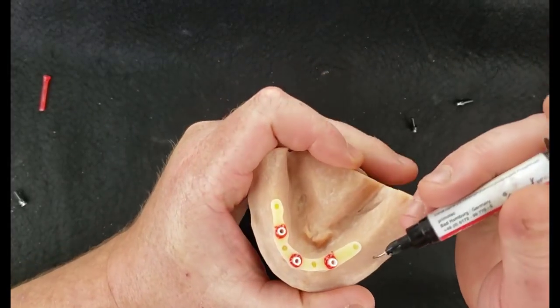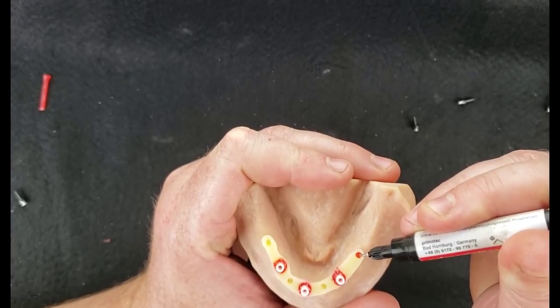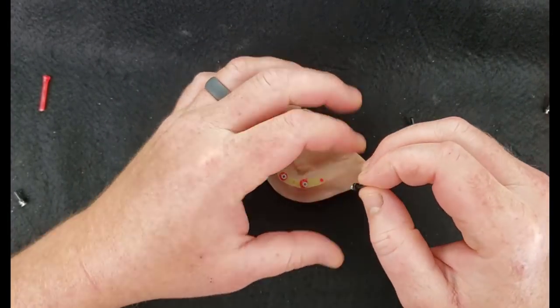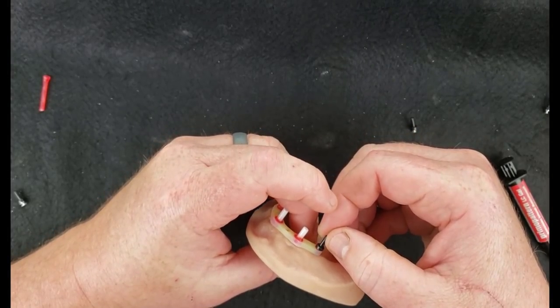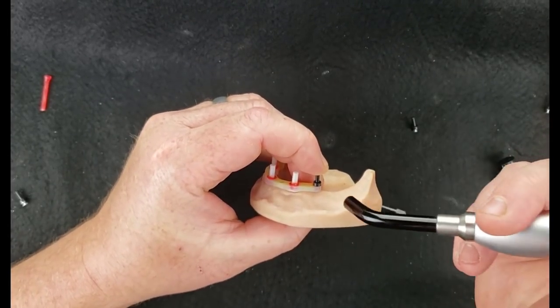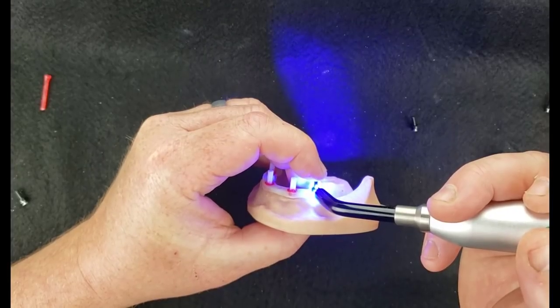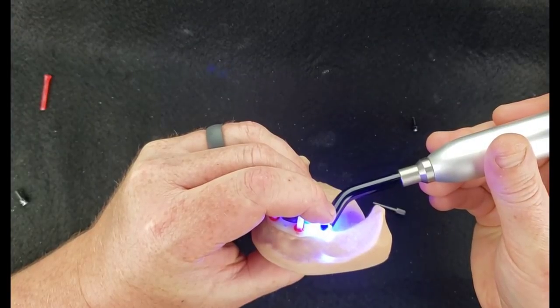So again, this is just a little trick that I did where I made the wells to accommodate that bottom portion of that. So I'm going to fill it up most of the way, and then just take the cast 2 locator, press it in to the hole, make sure it's sitting nice and flush, and then cure it. And these little black things that you're seeing, those are just the pieces that snap onto the top to give you something to hold on to these, because they're little bitty things.